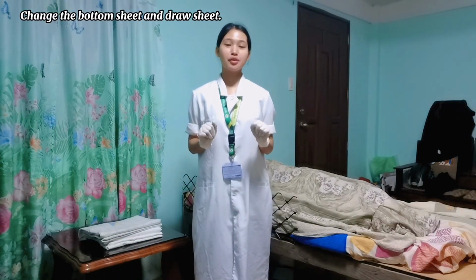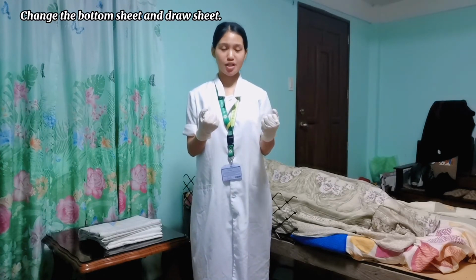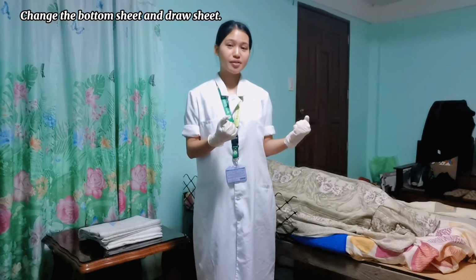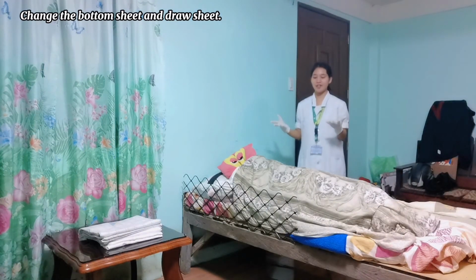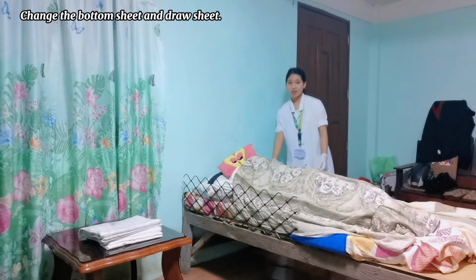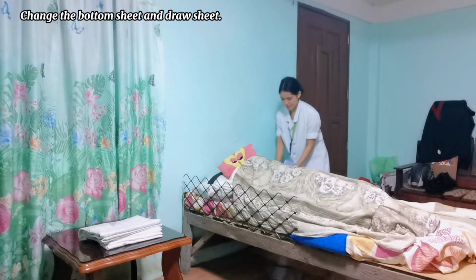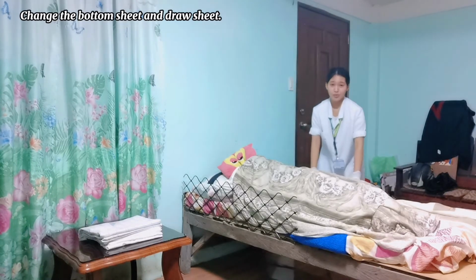And so, after putting the gloves on and performing hand hygiene, we are now ready to loosen the soiled bottom sheet. So now that we have moved the patient to the clean side of the bed, we are now going to remove the soiled bottom sheet on this side by loosening the edges on the mattress. And then roll it over inwards.